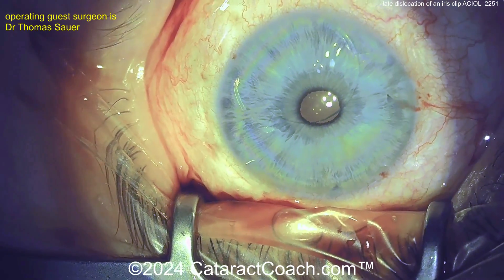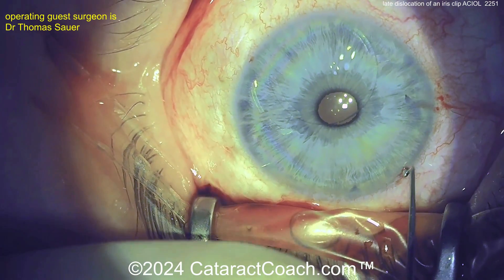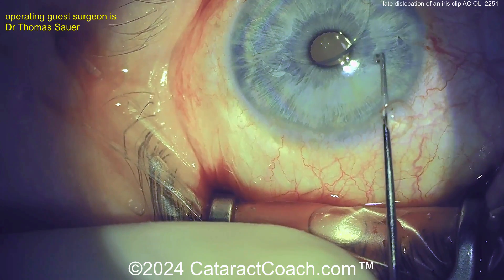You can see there's the IOL. The surgeon is sitting superiorly. It looks like this IOL, which is an iris clip type design, has fallen off on one end.